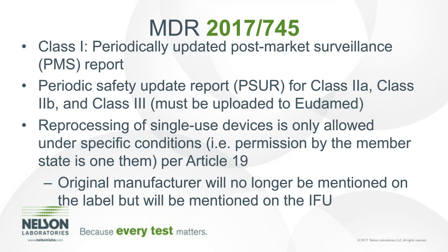Reprocessing of single-use devices is only allowed under specific conditions. Permission by the member state is one of them. And if you see Article 19 in the MDR, you will see that there is a lot of information regarding single-use reprocessing that Paul will probably go over and outline some of the specifics. One of the interesting things regarding single-use reprocessing is that the original manufacturer will no longer be mentioned on the label, but will be mentioned in the IFU.